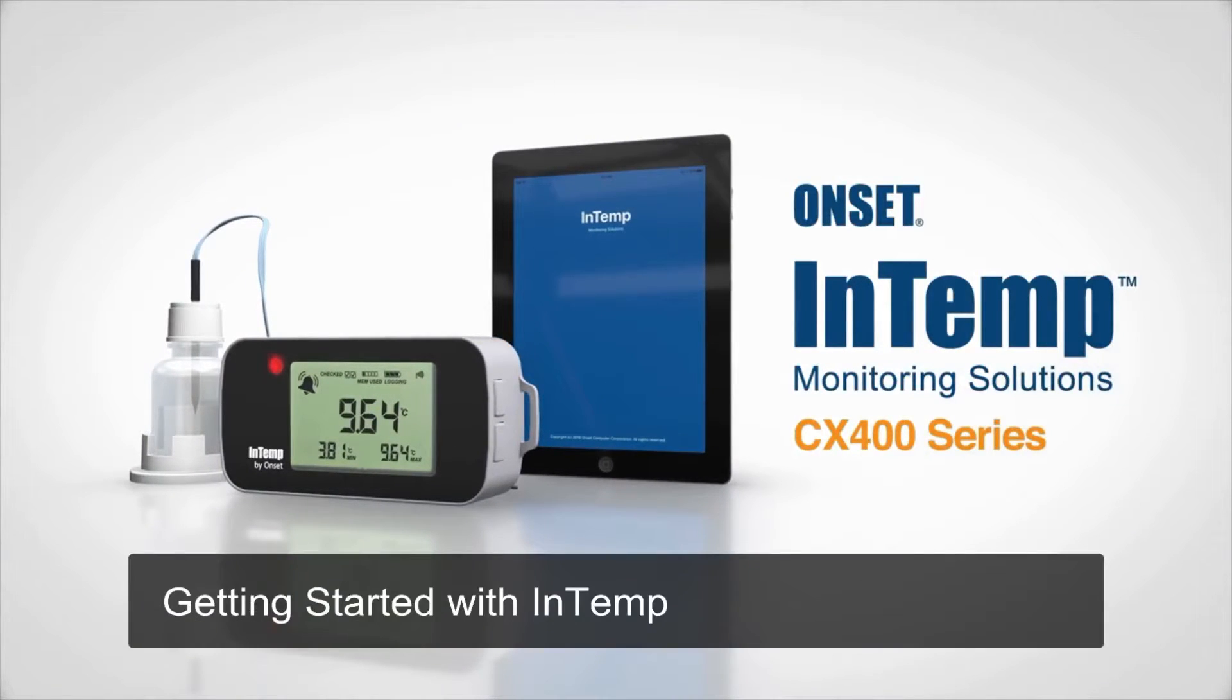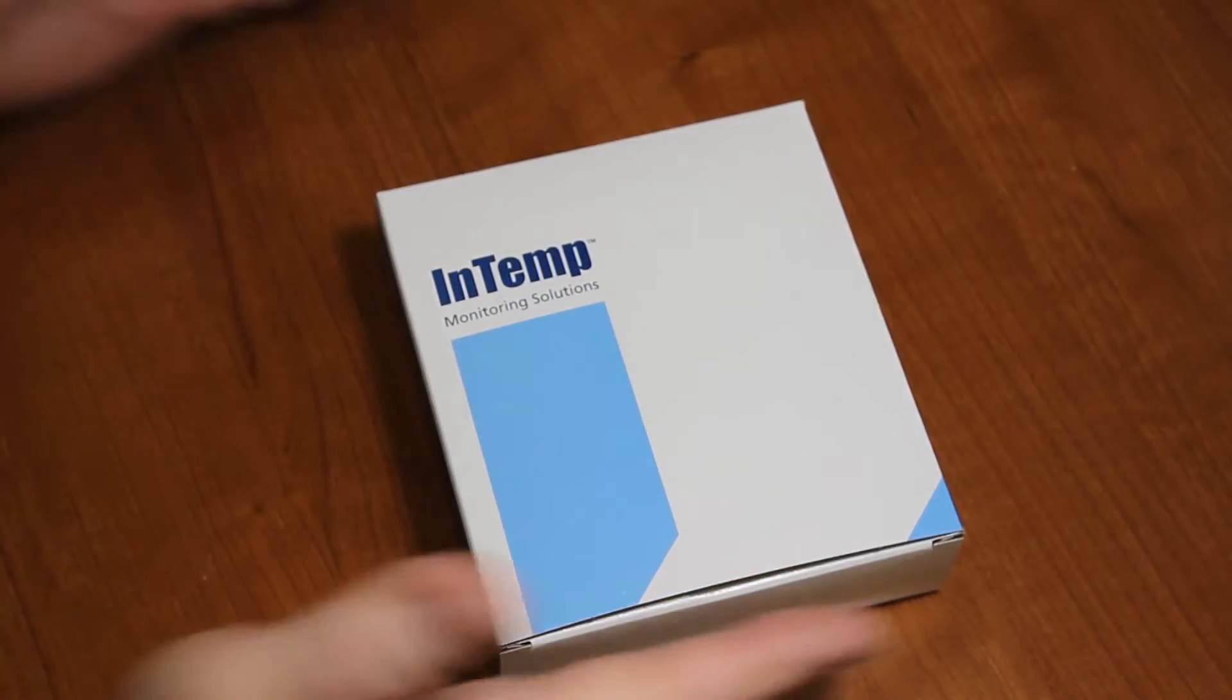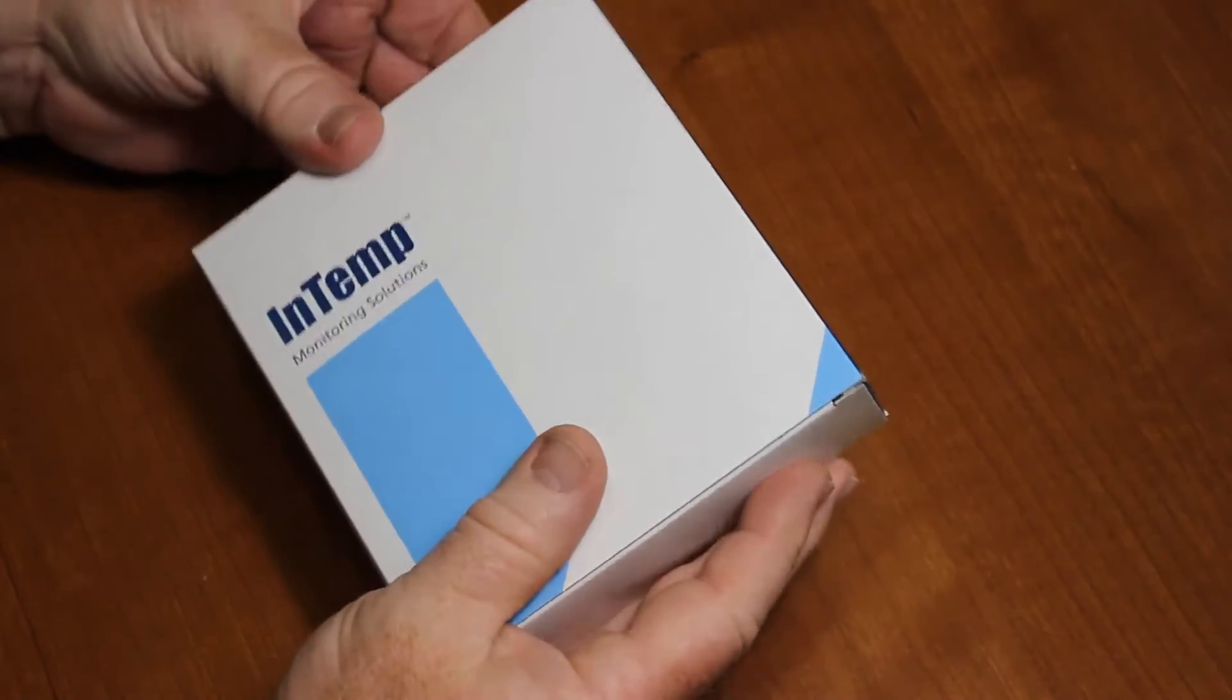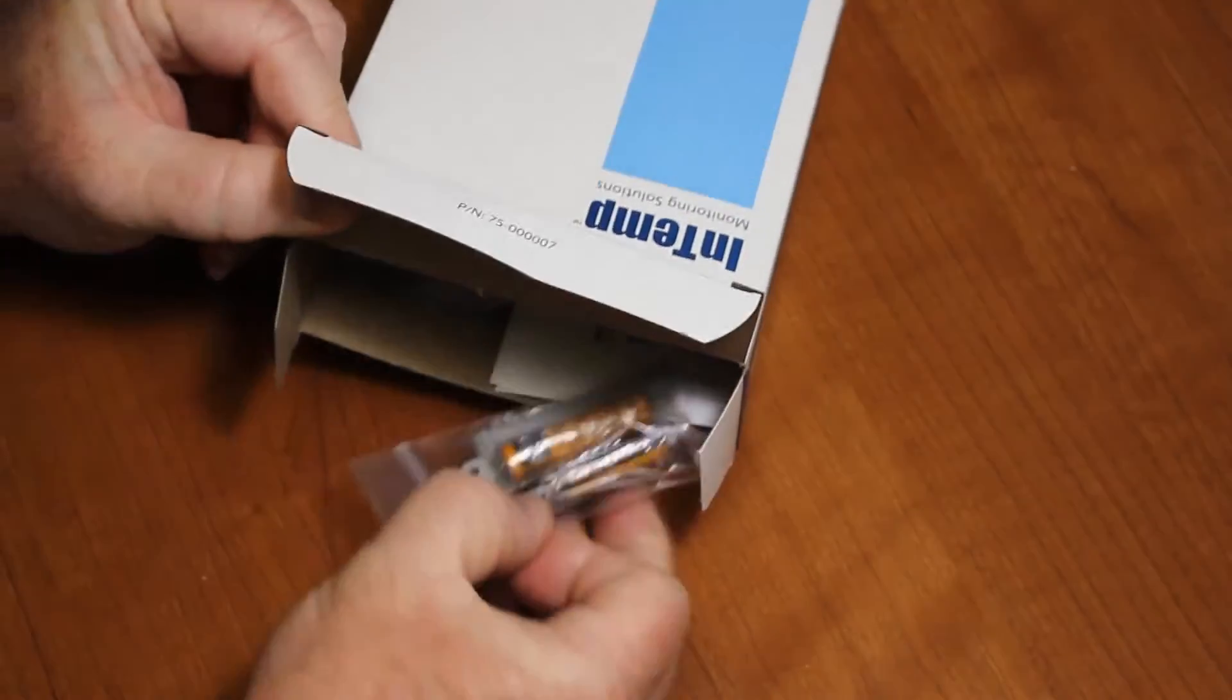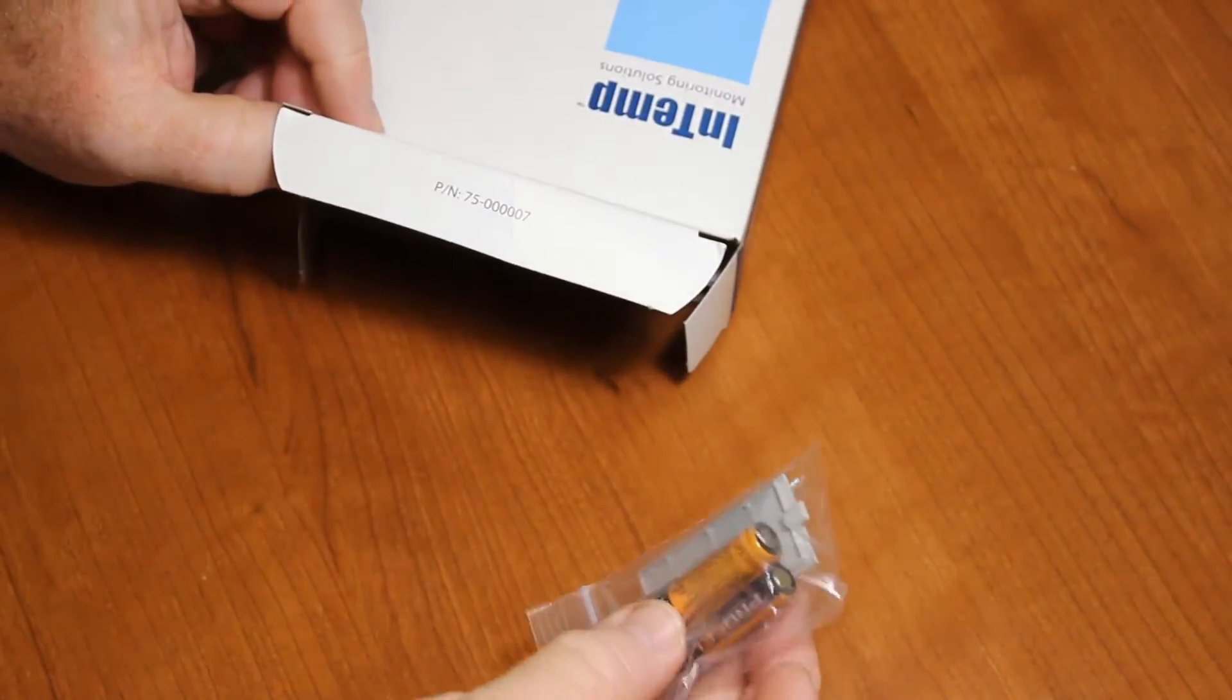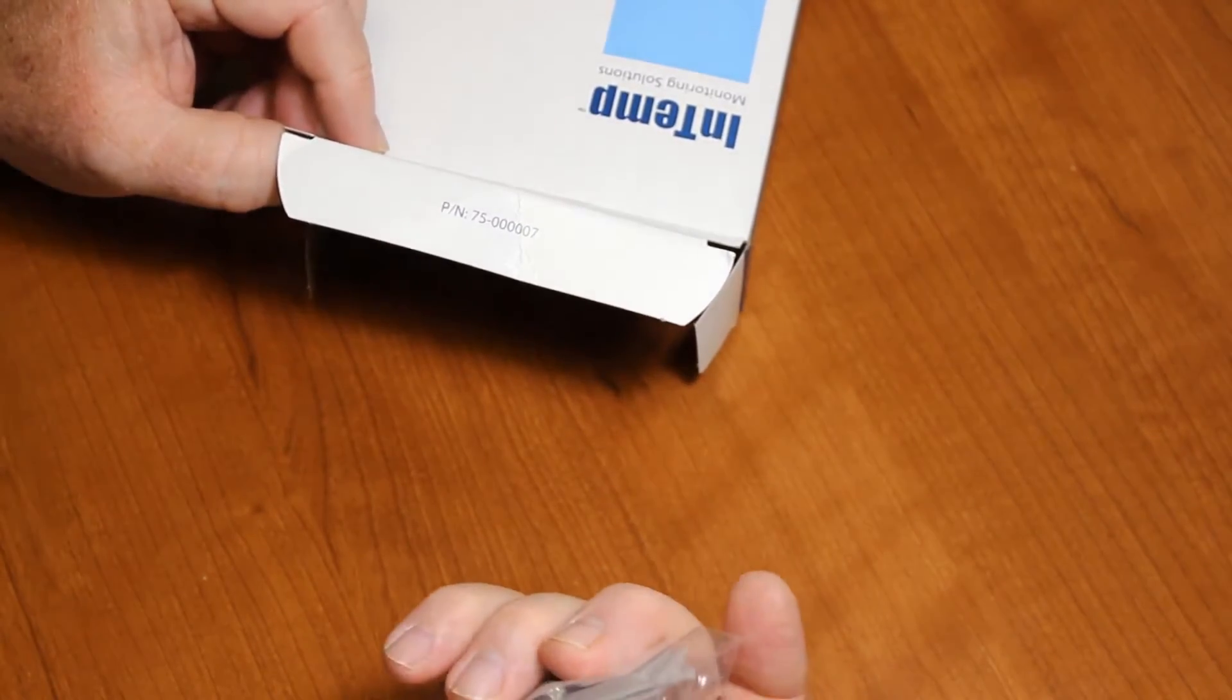Getting started with InTemp. Here is our CX-400 in its packaging from the factory. When we unpackage the logger, you will see you get the batteries, which are two triple-A batteries, with a little door to enclose those batteries.